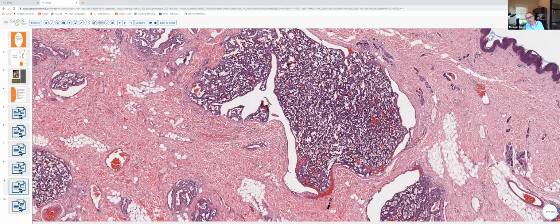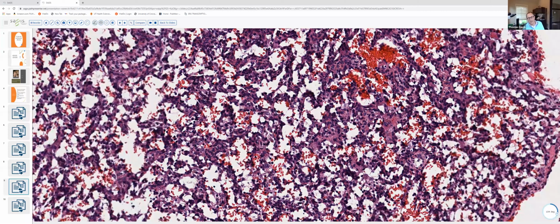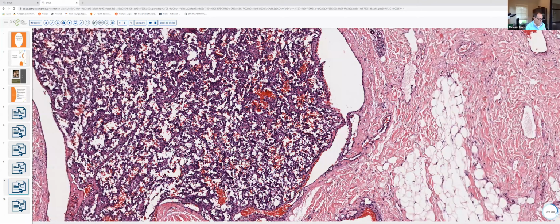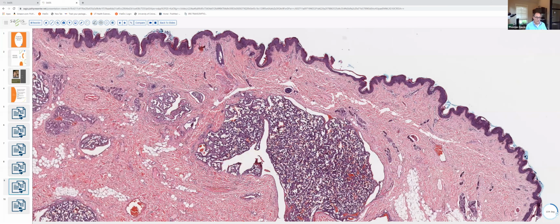And if you go in and look at the loops, you'll notice that there's no sequestration of degenerating erythrocytes in a tufted angioma. And of course, the clinical presentation is different. Tufted angiomas usually present as kind of ill-defined, slowly expanding plaques on the shoulder, a common area, of children. And they may be associated, of course, with Kasabach-Merritt syndrome.